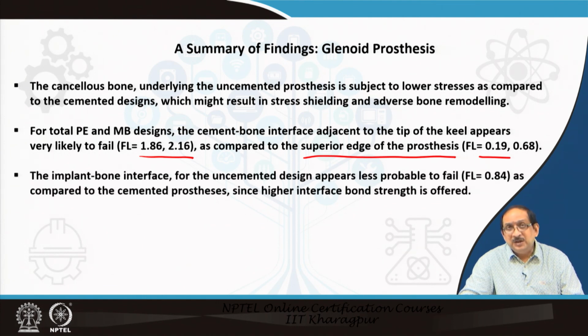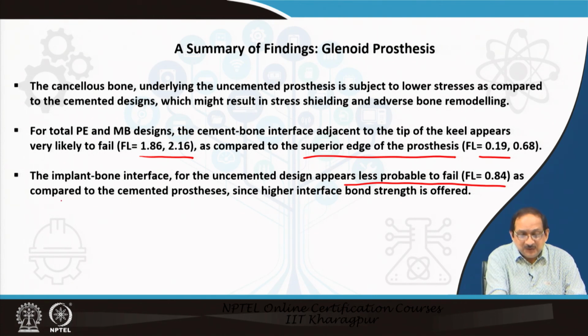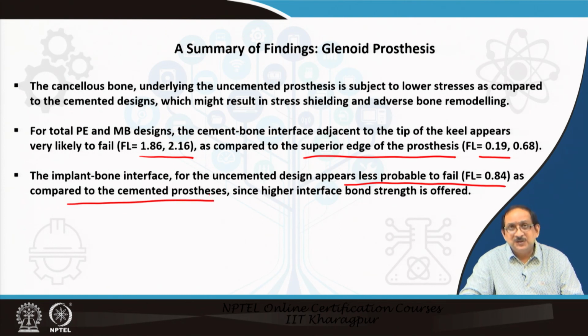The implant bone interface for the uncemented design appears less probable to fail. Very interesting, the failure index equals 0.84 as compared to the cemented prosthesis, since higher interface bond strength is offered in the case of uncemented design.